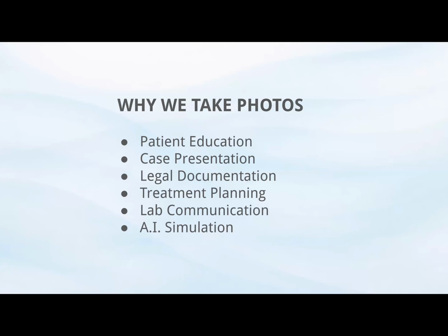For treatment planning, because, like I said, we can use it to formulate at least a couple of different alternatives for patients to be able to visualize what it is that we could potentially do for them, and we can communicate those options with them. And one of the main purposes is for communication with the laboratory. These photographs we're going to be using so that the laboratory understands what the patient's teeth look like, their smile, the soft tissues, and get a better idea of what the potential outcome could be.